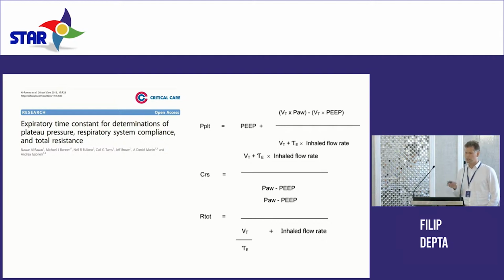So basically he substituted the time constant into the equation and got exactly the same values as he would if he had arrested ventilation, performing the inspiratory and expiratory pauses. So my question is, why is it still not in the ventilators? Why is it still not seen on the front screen so we can see how the lung behaves passively when the ventilator turns off?